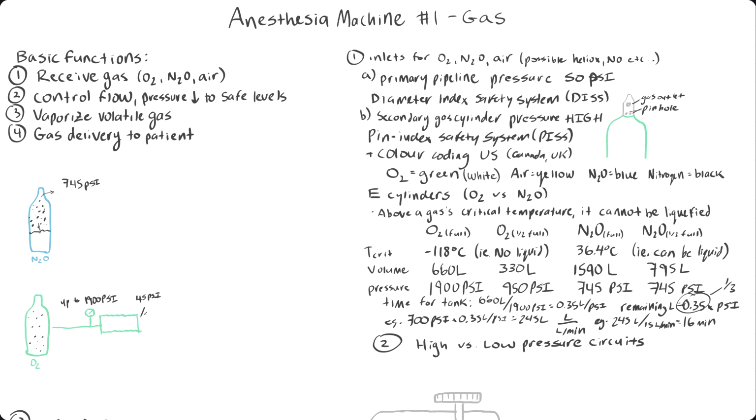And there's another good reason for this, which is our wall oxygen is going to be delivered at 50 psi. And these come together. We want our wall O2 to be the preferential source of oxygen going forward. So as long as this wall O2 is higher than the pressure coming off the tank, any gas flow through this circuit will be coming from the wall O2.